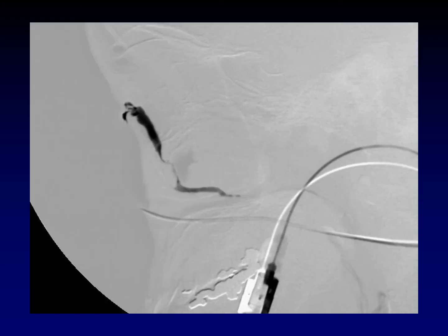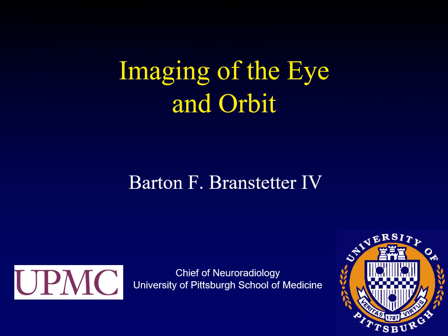This is an abnormal lateral projection of a dacryocystogram. You can see that the upper half of the nasolacrimal apparatus is dilated, and it suddenly tapers down to a very narrow segment in the bottom half. This is scarring and stenosis of the nasolacrimal duct with pre-stenotic dilatation. This concludes the lecture series on imaging of the eye and orbit.